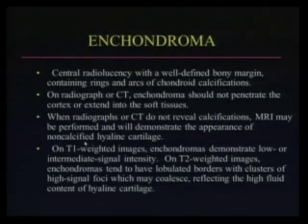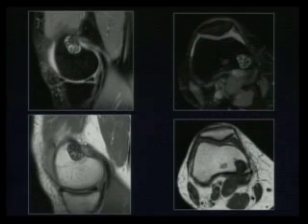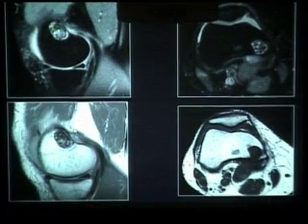On MRI, you will see chondroid matrix. Chondroid matrix is similar to free water. So you will see hypointense on T1 and hyperintense on T2. This is the same case, and you can see that the matrix of the tumor follows the signal intensity of the cartilage. See, white, black, and black. And then all the dark hypointense foci are the calcifications of the chondroid. Usually, in order to call an enchondroma, you want to see the arcs and rings. Okay? The only exception is in the hands. If you see a lucent lesion in the hands without chondroid matrix, it's enchondroma until proven otherwise.